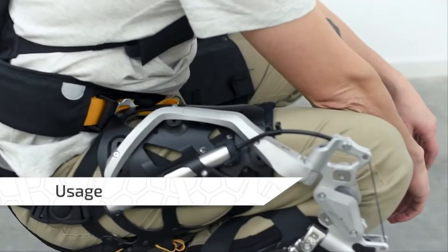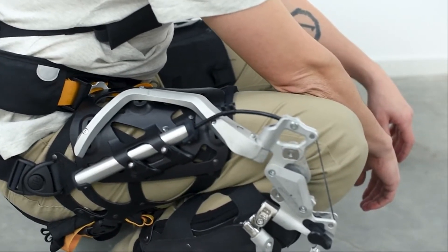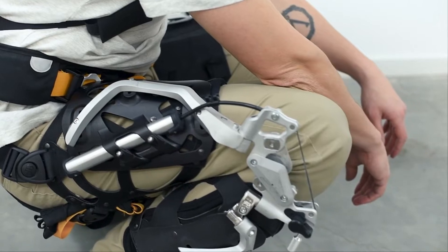The leg module assistance is conceived to operate at three levels of support and angle activation to help the user with squat movement based on personal preference.